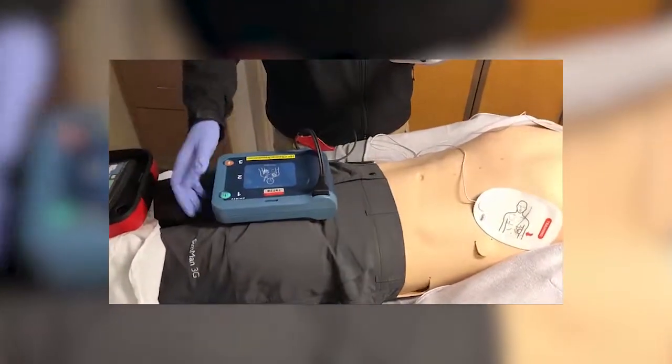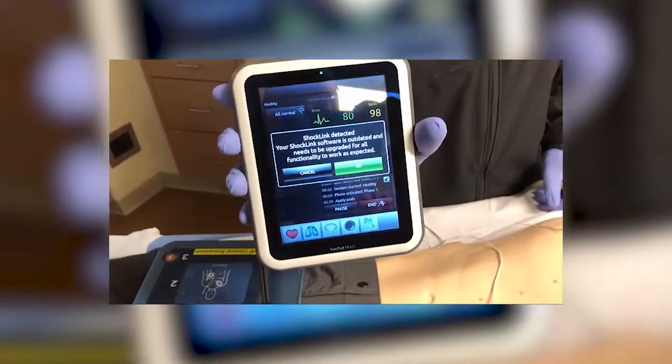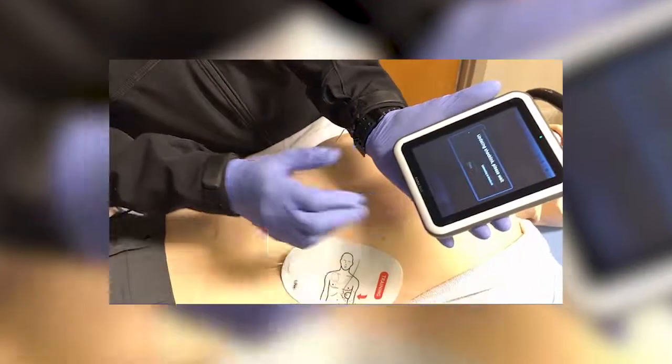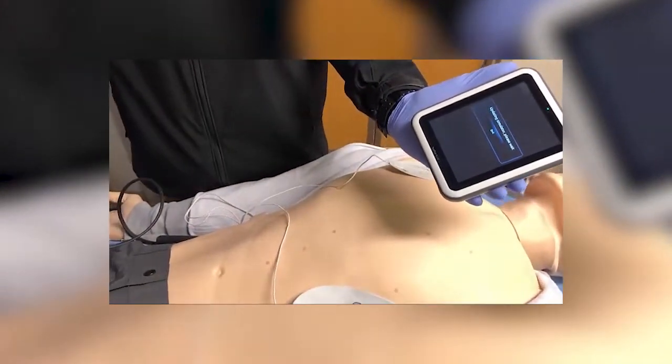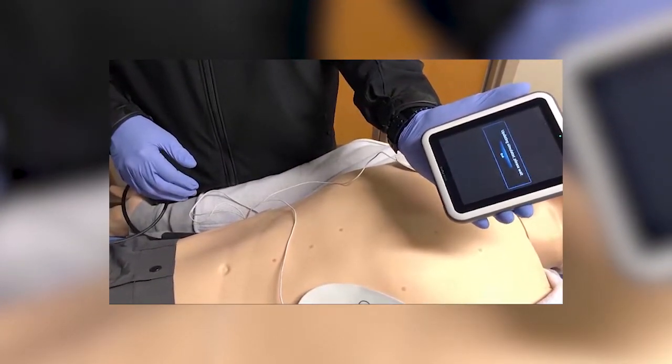That was a non-shockable rhythm. If you do see an update notification on your display, it is okay to update the shock link system. Do not update any other software, but if shock link says to update, you can do so by pressing okay. It will take probably about 60 seconds, so make sure the software is up to date and matching the software on the mannequin and SIM pad before you start.